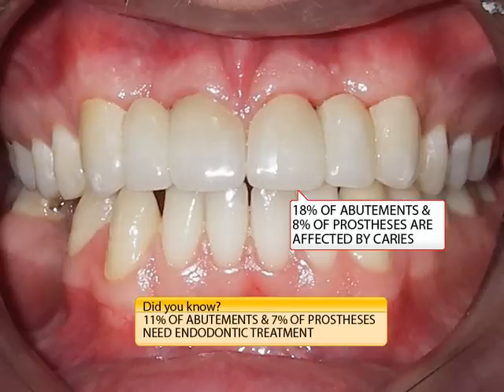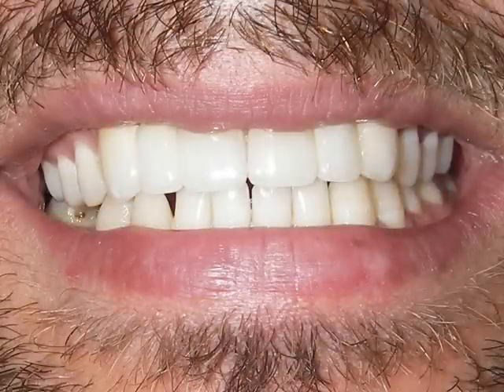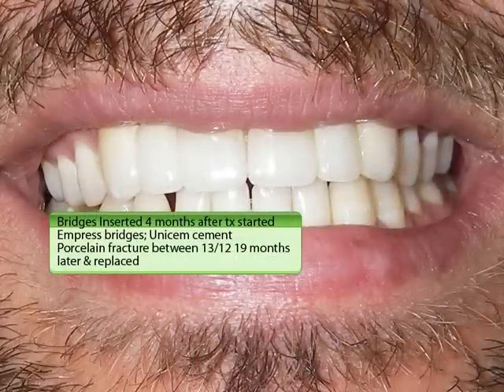I would use either a lithium disilicate like Emax material or a zirconia ceramic restoration. With good caries control prior to treatment and use of the Featherstone protocol both during and after treatment, the patient should have an aesthetic long-term result.